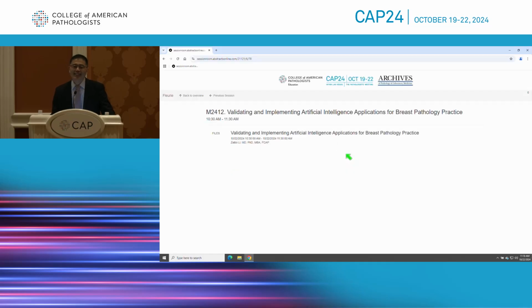Any questions? Yes. What's the workflow you adopt in your lab when you are doing AI with diagnostics? So as mentioned, first of all, you probably need a digital pathology workflow first, so you have all those digitized slides available at your finger click, right? When you select a digital pathology system, I hope you can select an open system so that it will be much easier for you to integrate third-party AI tools.